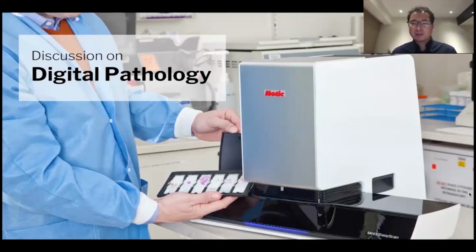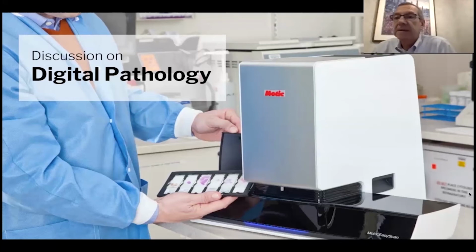I hate to bring it up, but during COVID, it's also hopefully helpful that at least you're minimizing travel. Oh, definitely. In many cases, we did not have a full staff lab during those times. Sometimes, just to keep safe, we would have some pathologists at home, and they would be able to assist either by consulting or even by actually interpreting frozen sections or immediate evaluations. The hospital was still open, but again, it wasn't always easy to have physical presence there during these times.